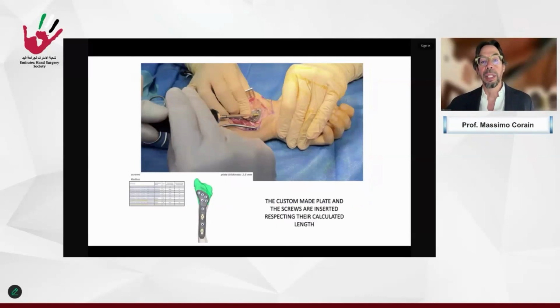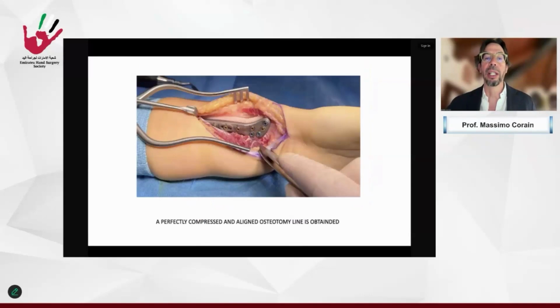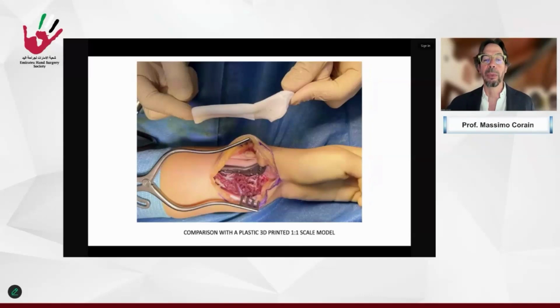Then we needed to put in the screws, as planned for length and number. This is the final check with the perfect matching of the osteotomy site as planned with the 3D printing model.